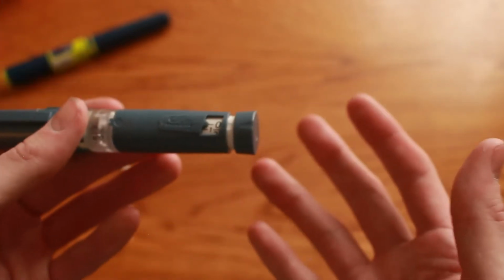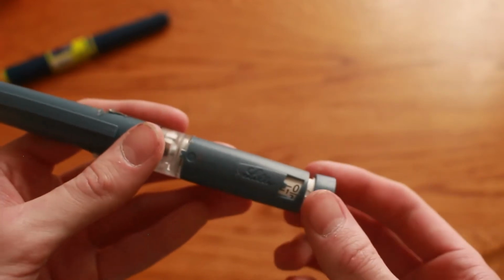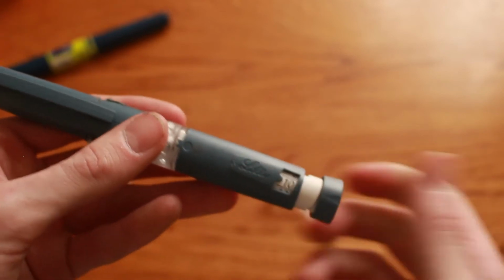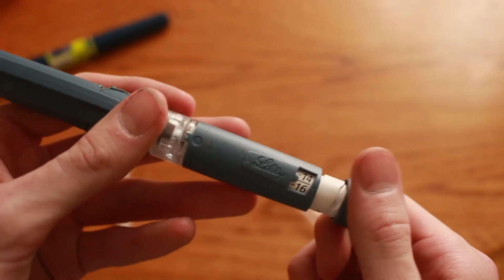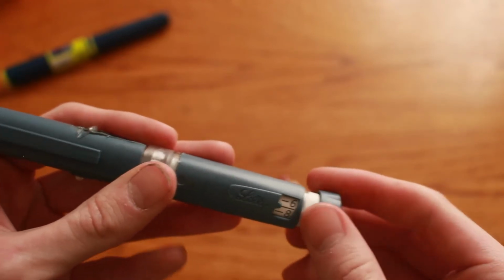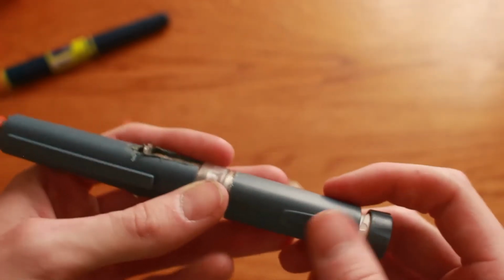I know it sounds too crazy to be true, and I thought so at first, but it turns out it works exactly like that. Literally, if I put 10 units in here and I push it down, it'll give me exactly 1 unit out of the syringe. If I do 15, it'll give me 1.5. If I do 7, it'll give me 0.7. If I do 2 units, it will give me 0.2 units of insulin.